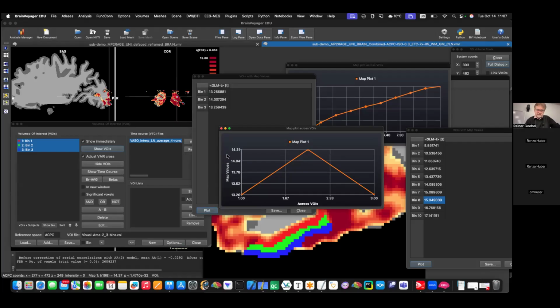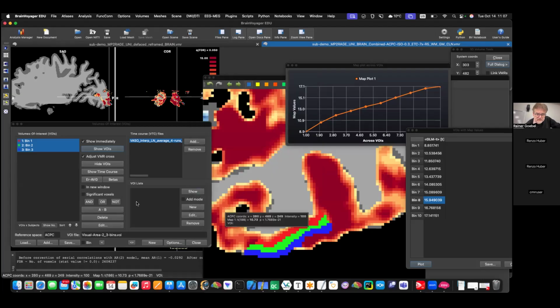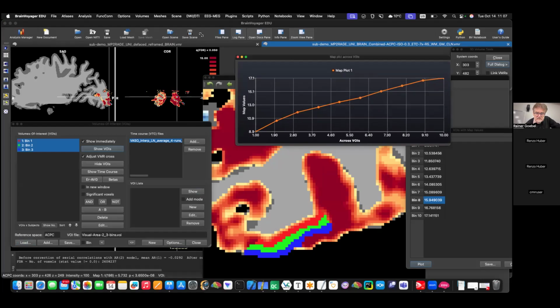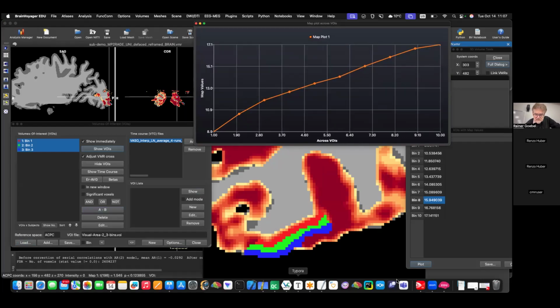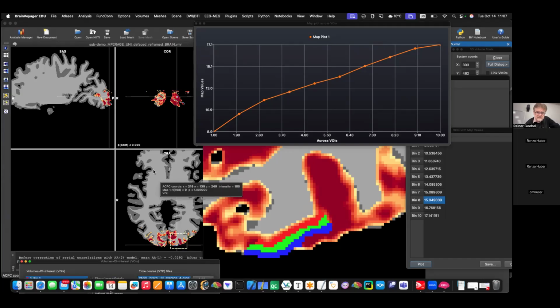But I think, for example, what you can do is you have the distance of each voxel in the distance map. You can export the distance and the t-stat and then plot it as a histogram over the distance space and not over the voxel bin space. But you need to write some code for yourself, because the distance map is already there, the t-stat is already there. So you only need to put them together if you want to.